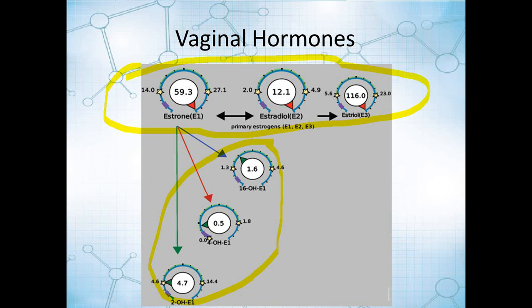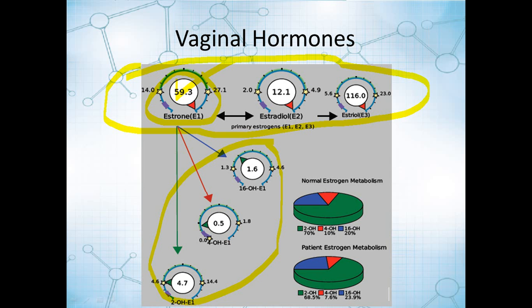Now, in a case like this, the patient's not taking estrone. That's E1. Since estrone is high also, that legitimizes these elevations because you can't contaminate with something you're not taking. So here you've got a high degree of the estrogens, but not as high a degree of the metabolites. You want to evaluate all of that as you look at the profile.